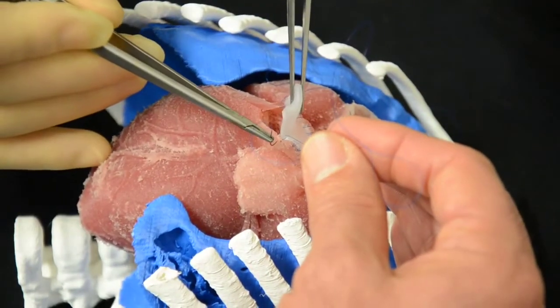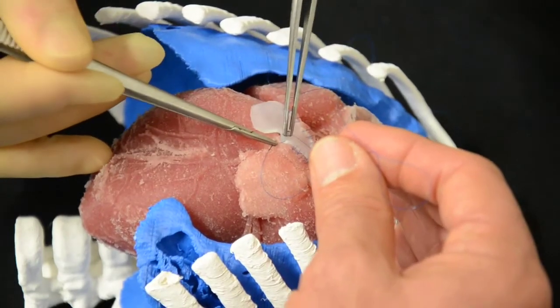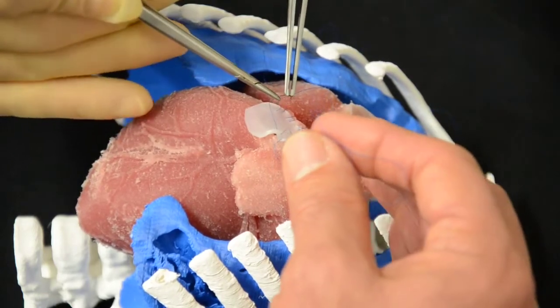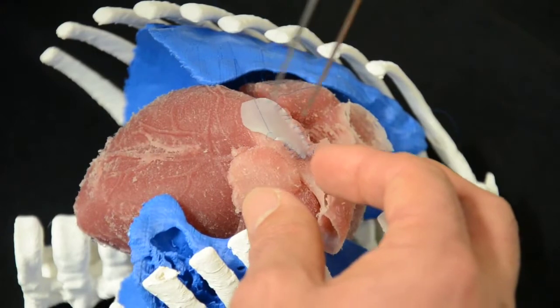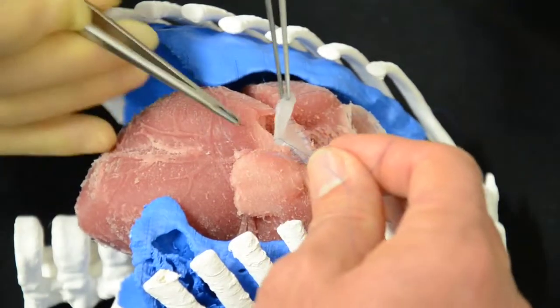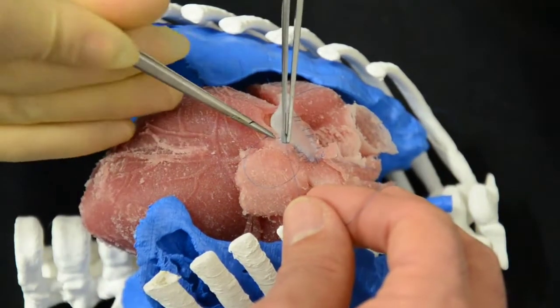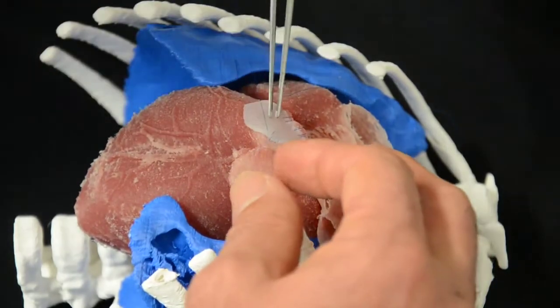This heart was reused. Imagine that when it's the first time, it would be a lot better. But so far, one of the significant differences for simulation is that once again, the texture of the tissues is very, very similar.